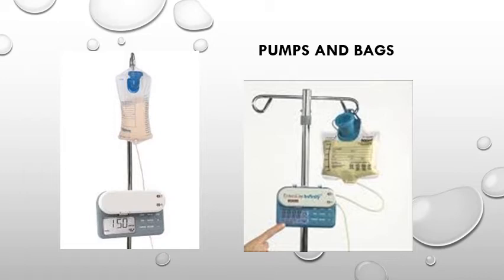Flushing the tube with water prevents the blockage of the tubes. Medications will be administered by the bolus method. Doctor-ordered water flushes may be administered bolus or pump. Tube feedings administered with a pump may run 24 hours per day and only stopped for water flushes and medications.